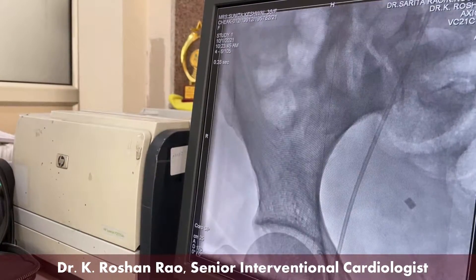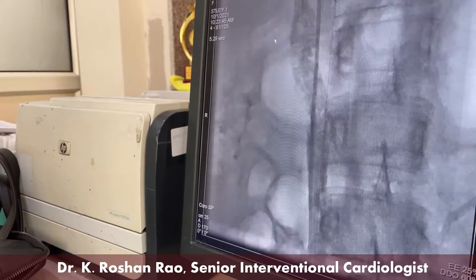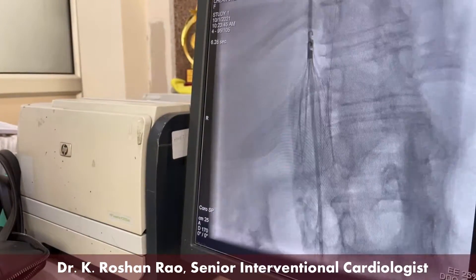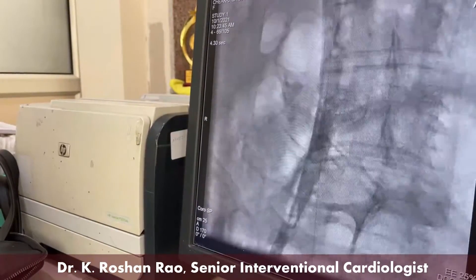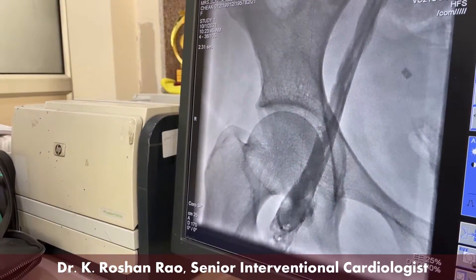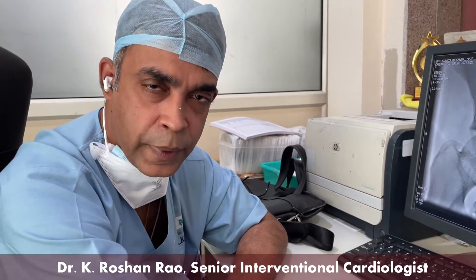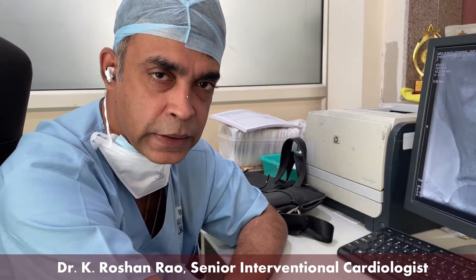We plan to give half-dose thrombolytics for another day because I want this clot to dissolve. We are saved by this IVC filter, because of which major pulmonary embolism is no longer a risk. Once we lyse this clot, post-thrombotic syndrome should not occur, which is the aim at this point. Because there are flows now, I would be happy giving oral anticoagulant to avoid post-thrombotic syndrome. We are giving SK for one more day and will take a shoot tomorrow and then reassess.